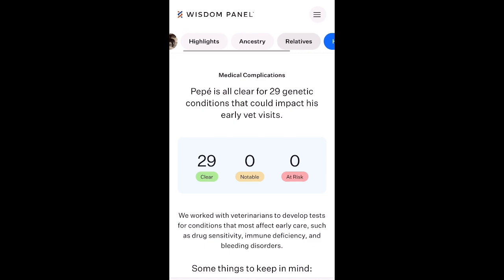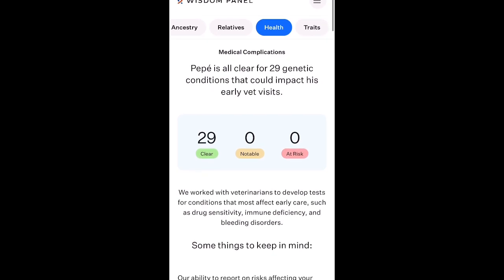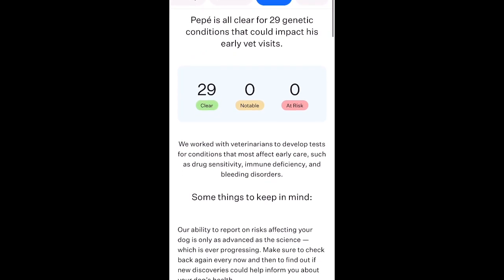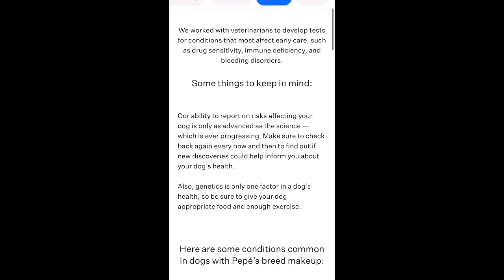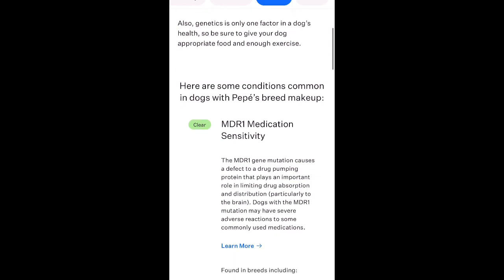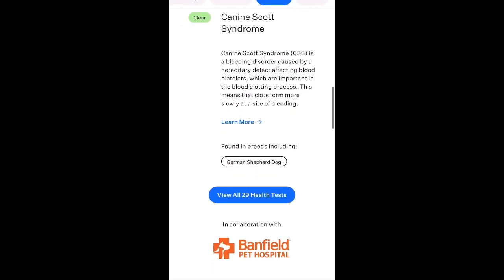And I also want to show you this little bar up top here. So we just looked at relatives, and now we're going to look at health. And surprise, surprise, Pepe doesn't have any health issues whatsoever with the breeds that he has in him. This is because mutts are generally known to not have any genetic health issues due to them being heavily mixed. And I'll scroll down here and show you some of the stuff that he is clear for.